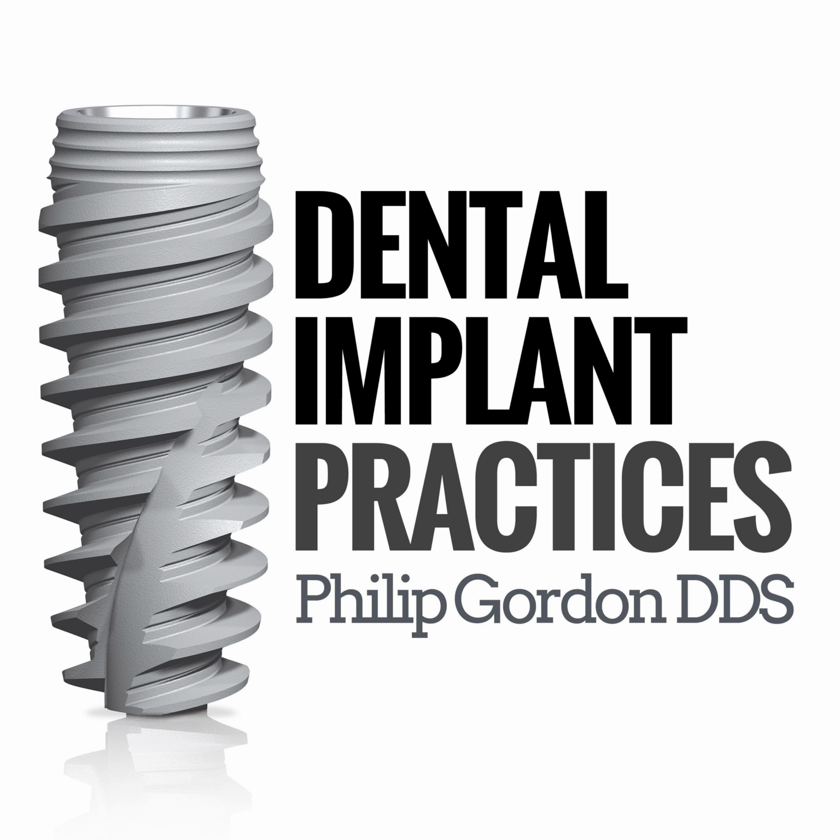With the NSequence guided prosthetic, we need what's called the Fantastic 5, is what we call it. That's our online RX, like we discussed, the Blue Moose bite, and the patient's CBCT scan. Now, with the CBCT scan for a full arch, if your scanner can, we want 13 centimeters of view. So basically from the tip of the chin right up to where the orbital sockets are, okay? We want all that because we want to see how everything comes together, including the condyles. We want to see that, okay?